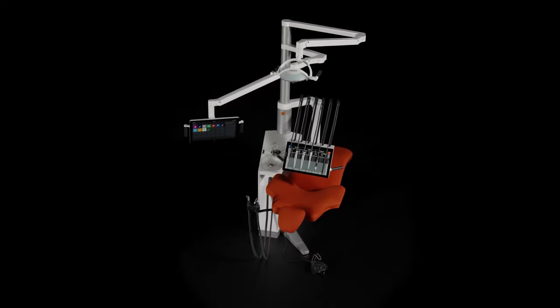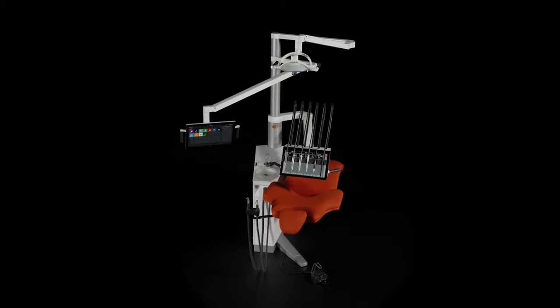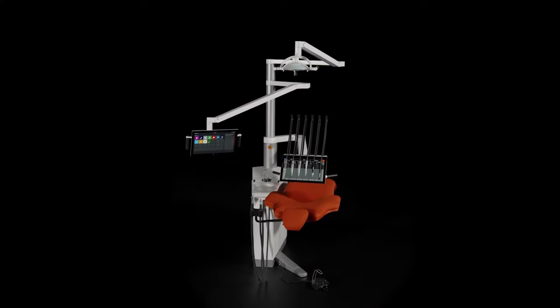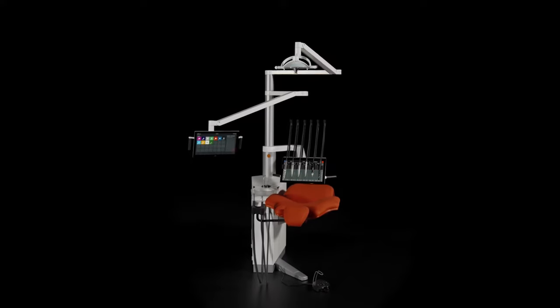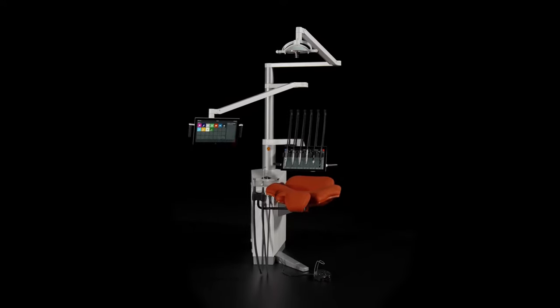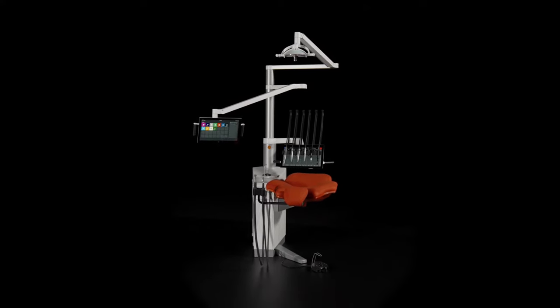The dental industry is undergoing a significant transformation as practices are becoming larger with many employees, and health authorities require standardized treatment protocols. To address these trends and based on years of research and understanding of customers' needs, we've designed ExoFlow.